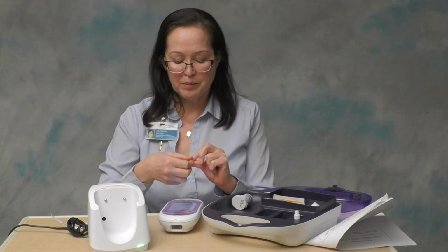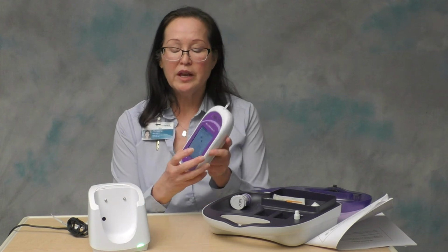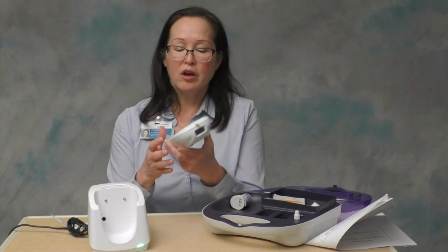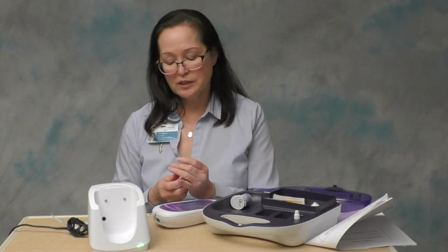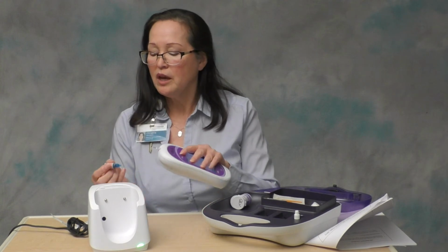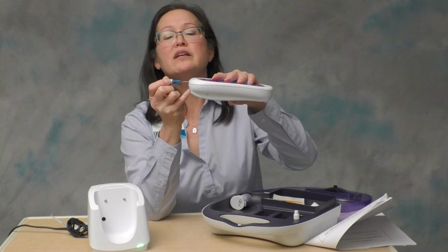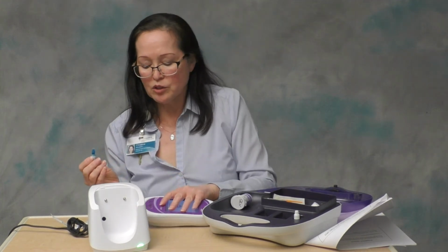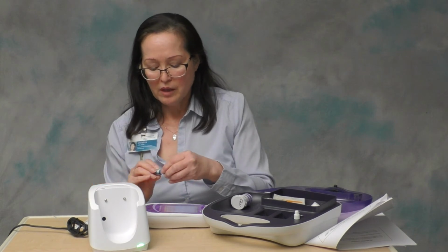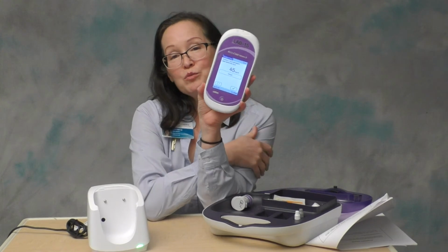And you can insert the strip, gold chip in, letters facing up. It has to read the code key on the chip once it's inserted. And then you'll see an icon of a drop going onto the strip. You know it's time that you can dose it. So again, you want to make sure that you hold the meter horizontal when you're dosing. I just make sure that I've got a little bit of solution in the tip of the bottle, and it's going to be that KISS technique, tip to tip. It will wick in that 0.6 microliter. And then I'm going to take the strip out because I always take the strip out before I hold the meter up. Then it's going to give you the result.